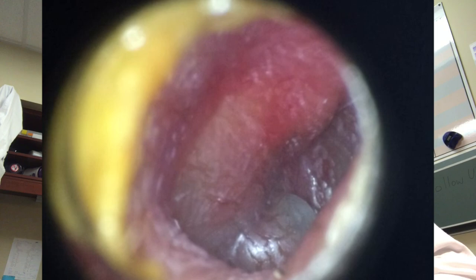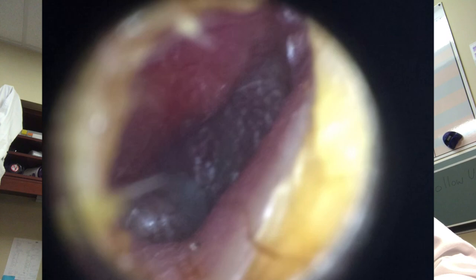That is a normal autoscopic exam with a normal tympanic membrane. This is the same patient's opposite ear, and you can see the redness of that tympanic membrane — it's very red, dull, and not shiny anymore. The distal, southernmost portion is a little shiny. This is otitis media with an effusion, meaning there's fluid behind the tympanic membrane pushing it out. There's some wax but the canal is intact.